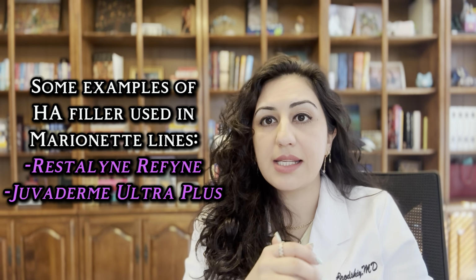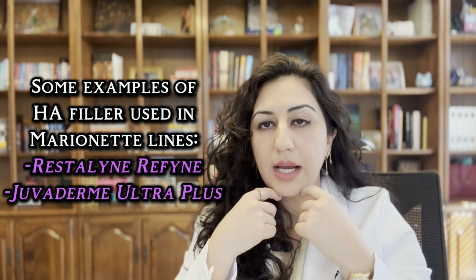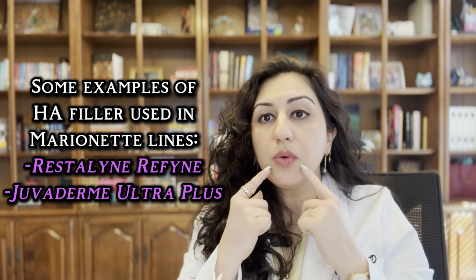The marionette lines, again, once you inject them as well, you have to do it after you've obviously done the chin, the jawline, okay? It's just little tweaks. And because you've already put more filler in here and around the jaw, you will need much less in these areas over here, okay? So you are saving your patients from having to use more filler.